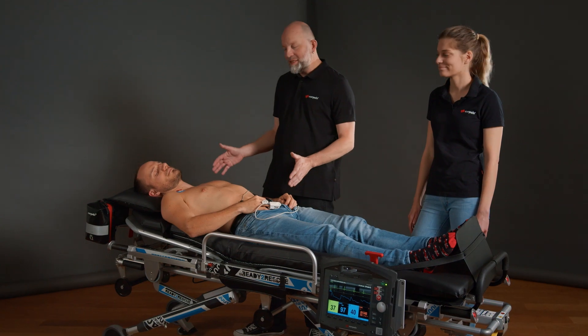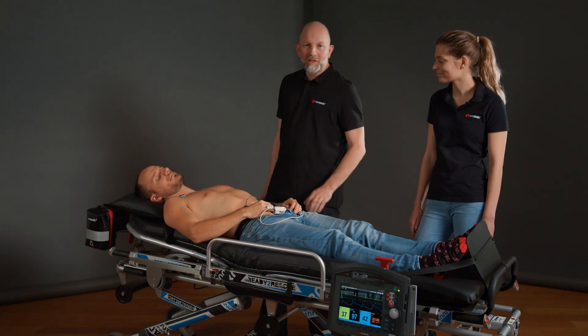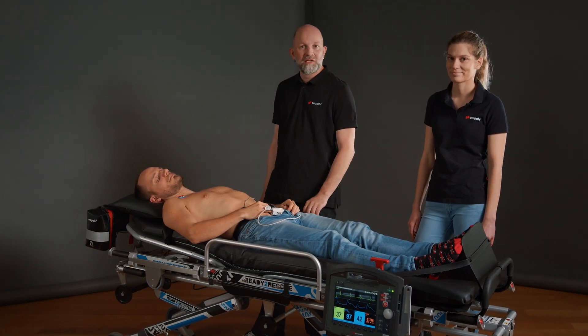But let's actually take a look at this in practice. We have already prepared the patient with a monitoring ECG. In this case, we positioned the electrodes on the torso to reduce any possible movement artefacts.